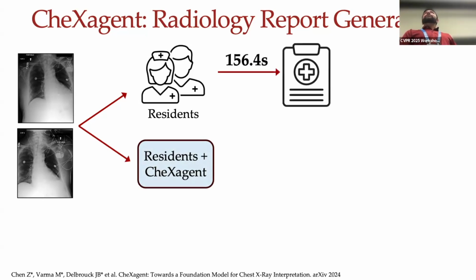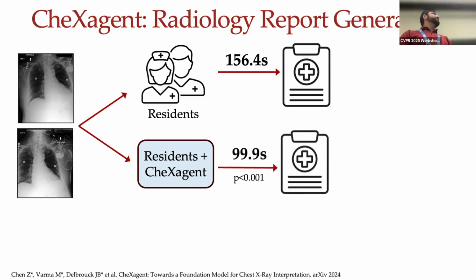We timed how long it took these two groups to generate the first draft report. And when we compared the residents working alone to the residents working with this CheXagent model, we saw a substantial improvement in time. I wouldn't necessarily take these numbers as gospel because we're not using this in a clinical environment.